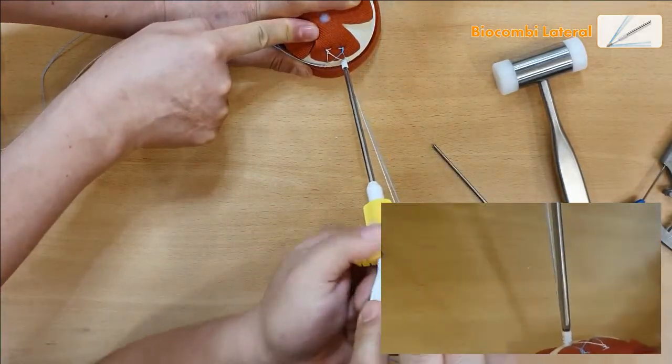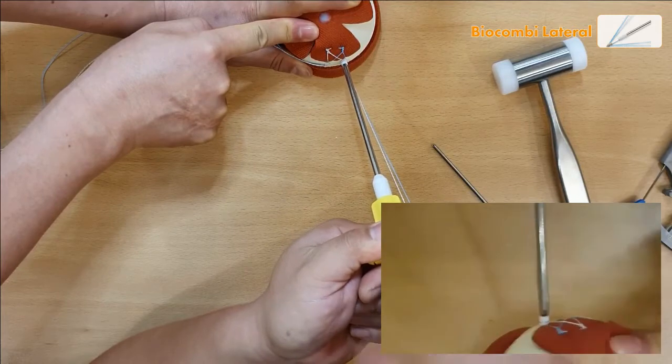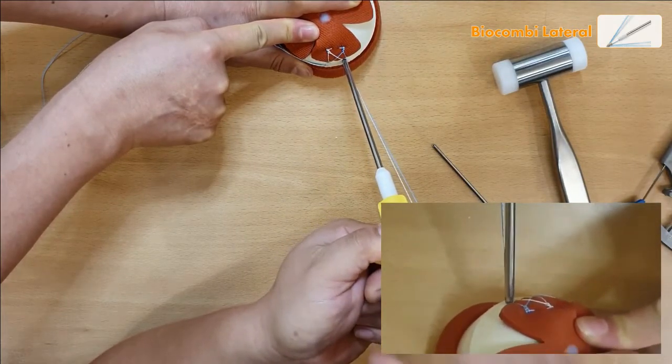And there is no twisting of the fiber wires as you can see. There is no more tension going onto the cuff.